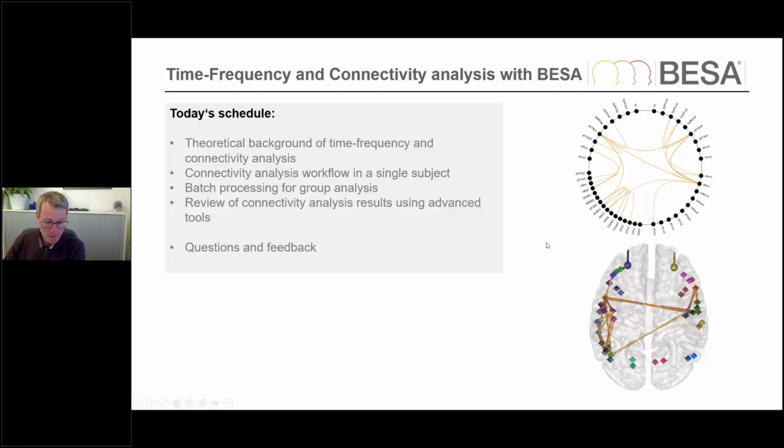And a disclaimer, I will be demonstrating some brand new features using our beta version of BESA Connectivity 2.0, which is not actually on the market yet. However, it will be released shortly and can already be ordered. Altogether, I expect this webinar to last for between 45 minutes and 1 hour.